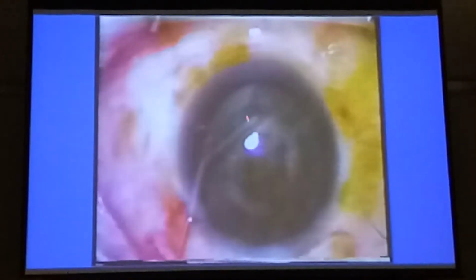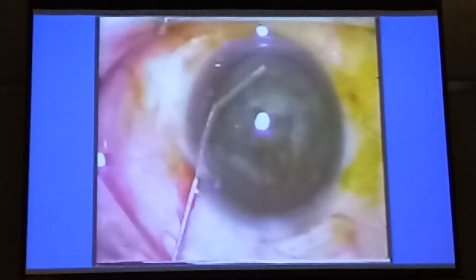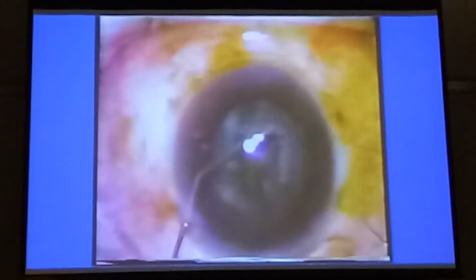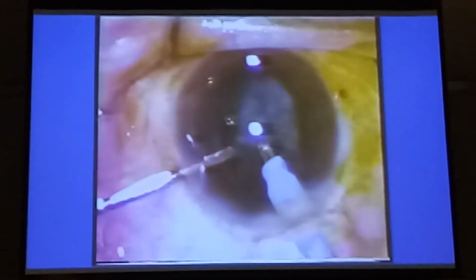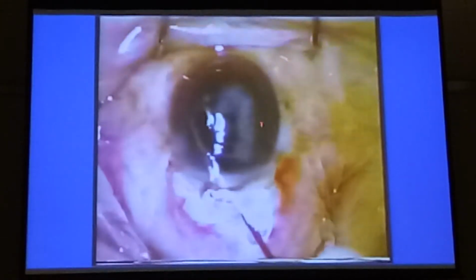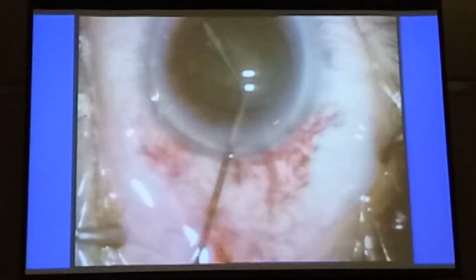This is my index case, hydrodissection through the side port. Now just watch as I hydrodissect, watch that pupil, that's the snap. You see that? The pupil just did that. Action replay. That's the snap. So the first time this happened to me over 20 years ago, I knew something happened, but I didn't know what. So when something happens during surgery, you go slowly, and it went on, and then the nucleus started dropping and tilted, and I had to bring in a Vectis to rescue it.